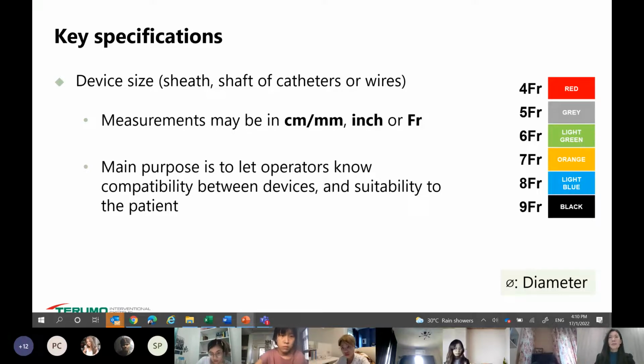Like for your guide wires, they will put the guide wire into the tray of saline with heparin. It always happens. So for all devices, once they are used, or before using, they may also dip it inside. So this is one thing to note. And why do they do this?